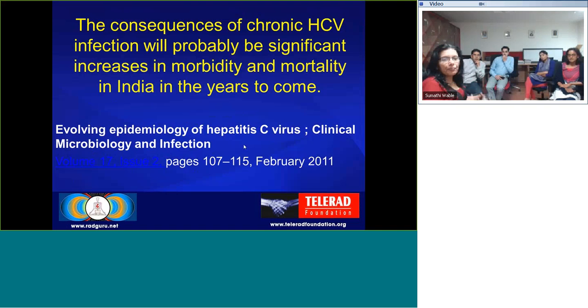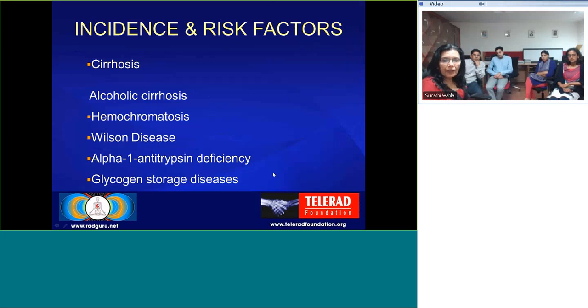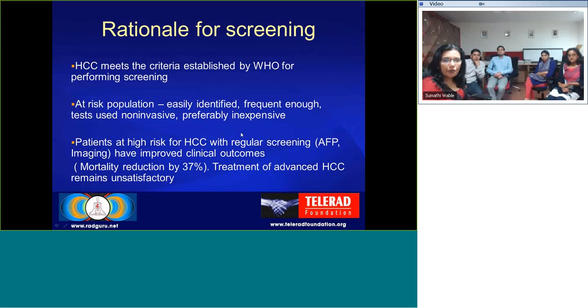Basically, the things that I want to show are how you parse out the nitty-gritty, how you identify the common lesions from non-common ones, and what are the ones that should raise red flags for you that this could be HCC. So we're going to skip over this since we already talked about it.